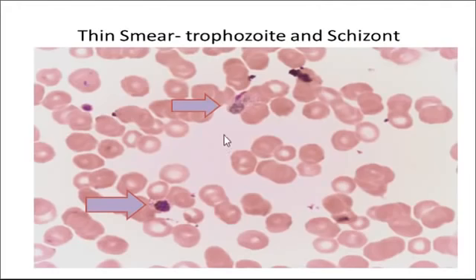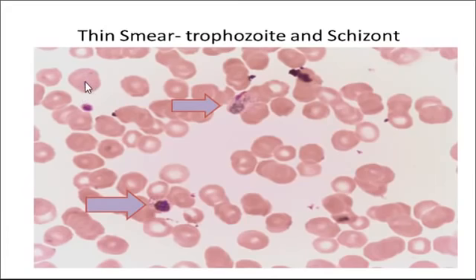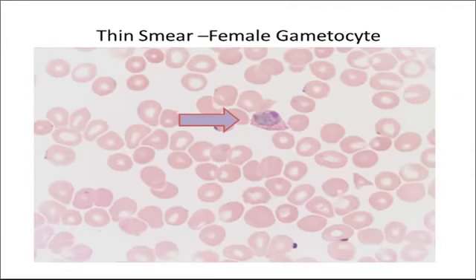This field shows both a trophozoite and a schizont. Below and above, you can see an amoeboid — a shapeless amoeboid form — in an enlarged RBC with Schüffner's dots. There is also a ring form at the extreme left which is not marked.